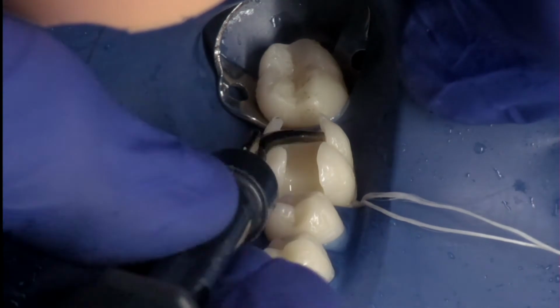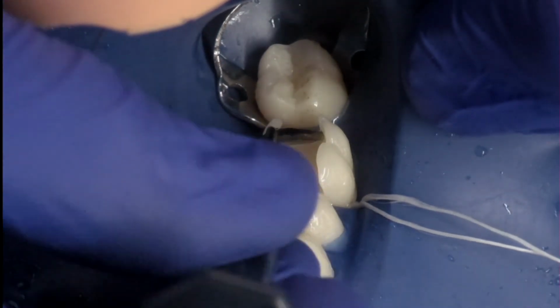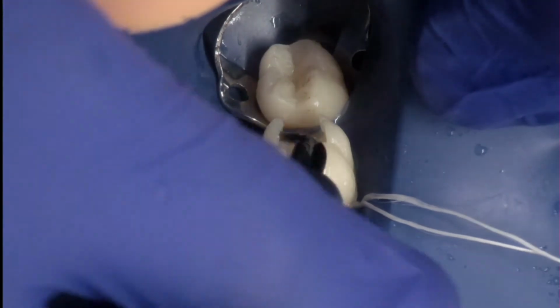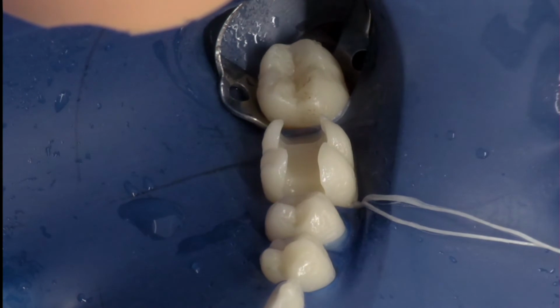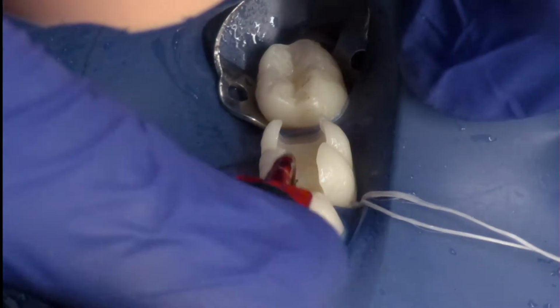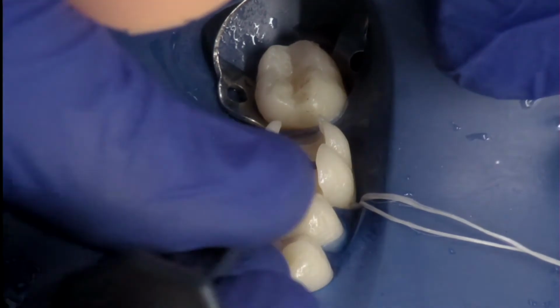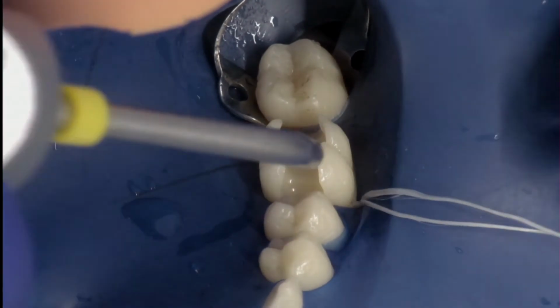Here's our self-etch and primer in one. This does not get cured, but it does get air thinned. And finally, the bonding resin. This is to be painted on for 10 seconds and it should be dried until it no longer is mobile, or until it's completely dry. Once that is complete, you want to cure for 10 seconds.